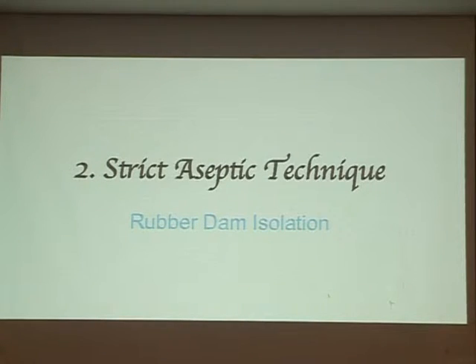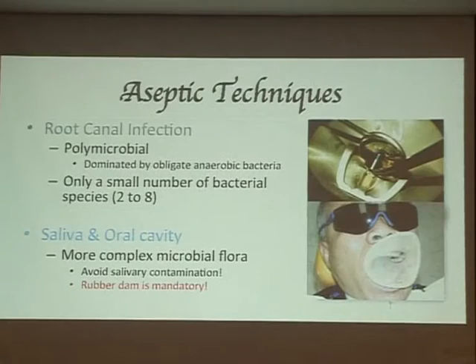You can prepare a curved canal very beautifully, but without rubber dam... Sorry, I got a case sent to me by a Chinese endodontist. He sent me a case, very curved, 90 degrees. He finished. He wants to publish in a journal. I said, okay, but you need to do it again. Why? Because in your X-ray, there's no rubber dam. Nobody will accept your case report because it deviates from standard practice. So rubber dam is very important.